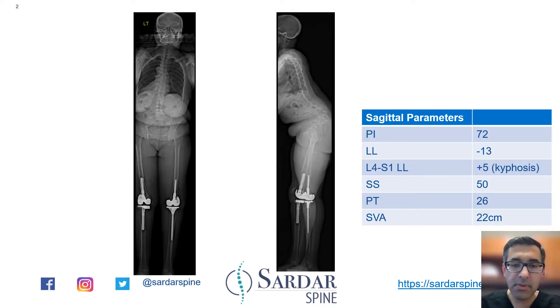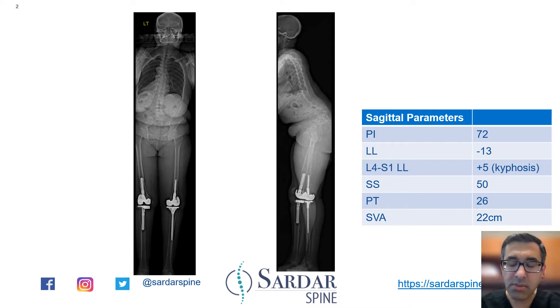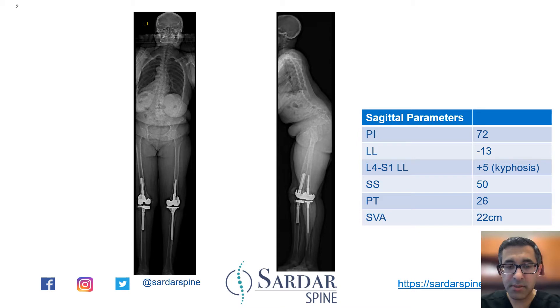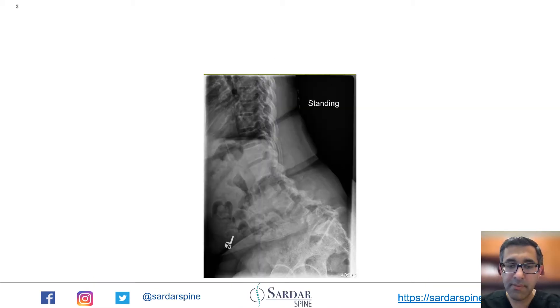Here are the full standing AP and lateral x-rays of this patient. You can see that the patient has quite a significant mismatch of their pelvic incidence to lumbar lordosis. Their lordosis is only 13 degrees with a PI of 72 degrees. From L4 to S1 they actually have a kyphosis of about five degrees, giving them a total SVA of more than 20 centimeters.